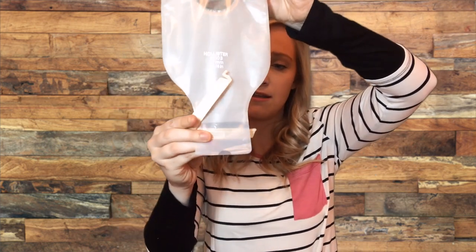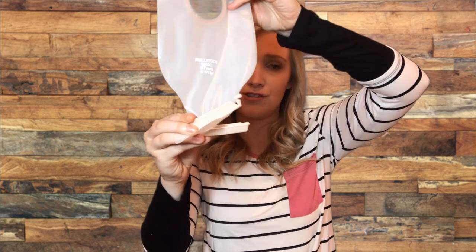This is Hollister 18183. There is another type of drainable ostomy pouch out there. This is a drainable ostomy bag — you can see that it's not closed on the end. But this one you close with a clip. You push the clip in to open it, you can put the ostomy output right here, and then you just snap it shut and wait until it clicks. It is drainable, but it uses an ostomy clip.